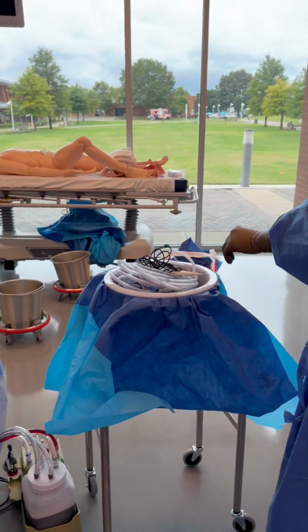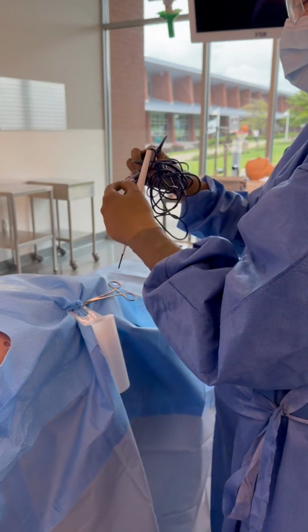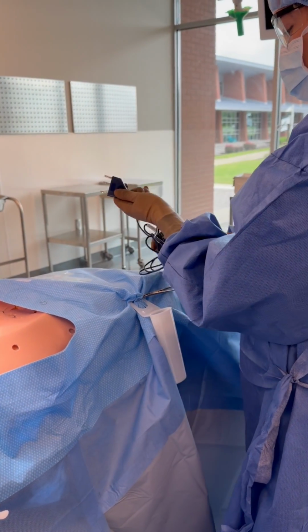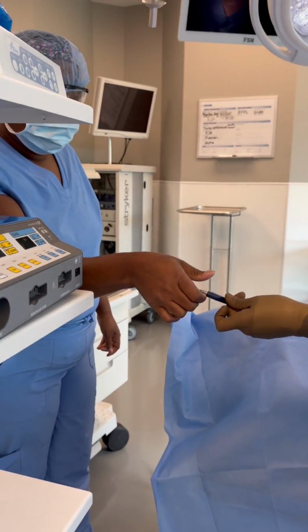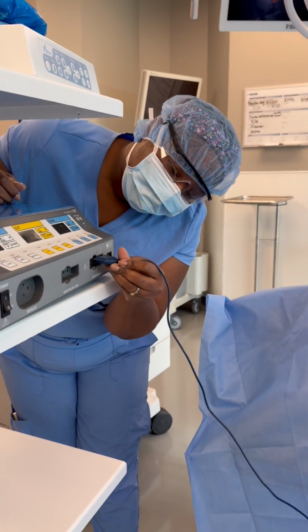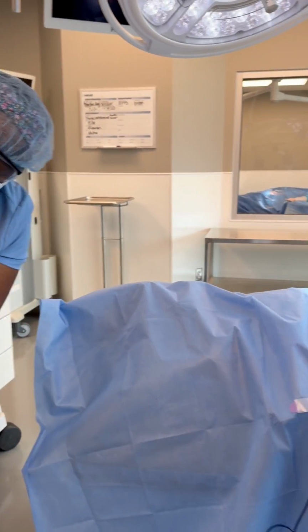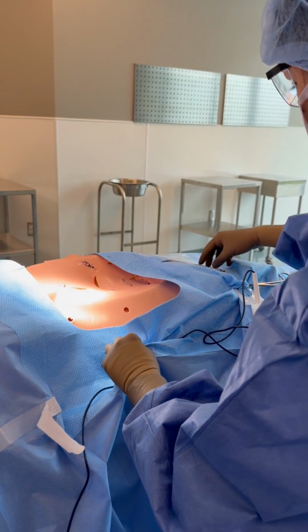I'm going to grab some other hemostats. I'm going to set up the bovie tip. Circulator, can you please grab the tip of it? And connect it. And then from there, I'm going to put the bovie tip there, and put this here so it doesn't get contaminated.